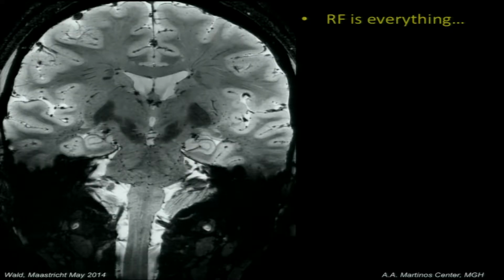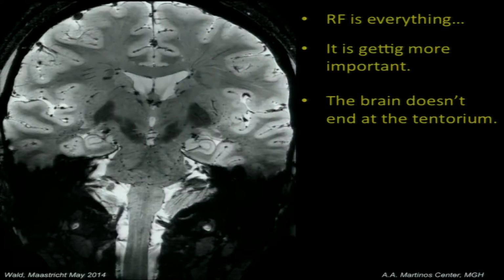So the premise of my talk is that you can get these beautiful 7T images. This is a standard T2-star weighted image, showing, in this case, we were really trying to get down the brainstem and pons, that RF is everything in these images. And it's going to just get more important. And the brain doesn't end at the tentorium, there's more to the brain than the cortex.